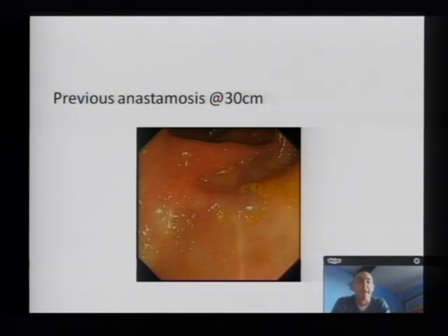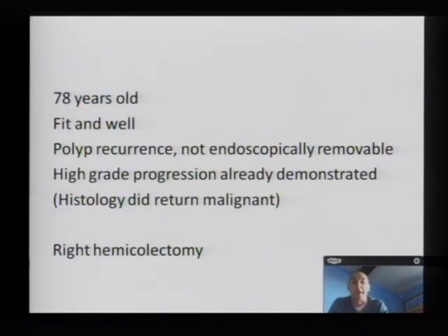from a surgical perspective. The old-fashioned rigid sigmoidoscopes have 1 centimetre markings all the way along the scope. The flexible endoscopes don't. They have 10, 20, 30, as obviously you're aware. Some of the measurements can get less accurate. So if we move on to the next slide, I'll come back to the measurement bit in a moment.